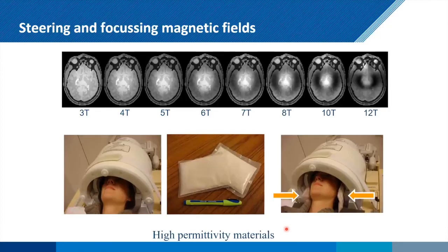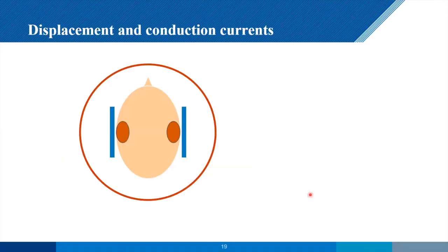So what we can do then is, we know that this problem is going to get worse and worse. And again, this is just basic physics. So we start to say, let's form some high permittivity material. These are just 2 pads over here. This is made of calcium titanate, so epsilon about 100. And essentially, we simply take all the software and all of the hardware standard on the system, and we just add these dielectric pads to the left and right.